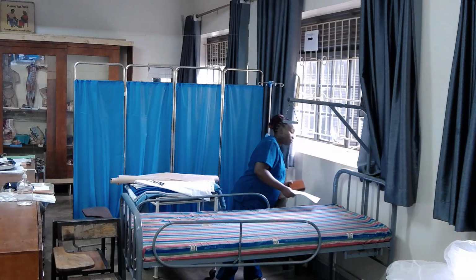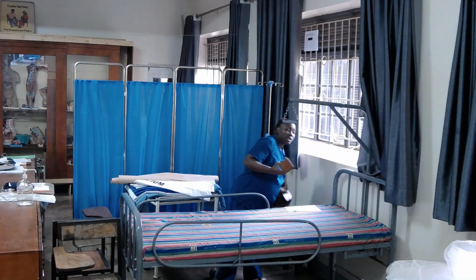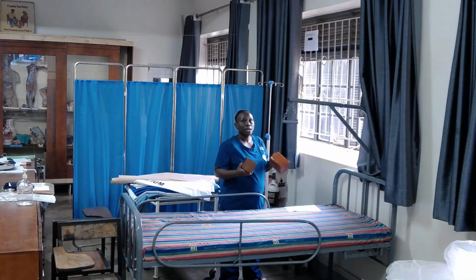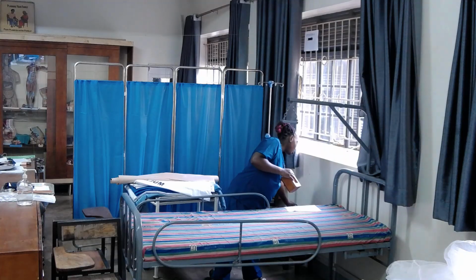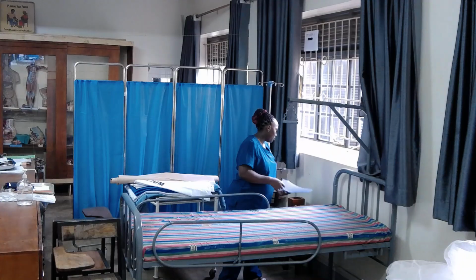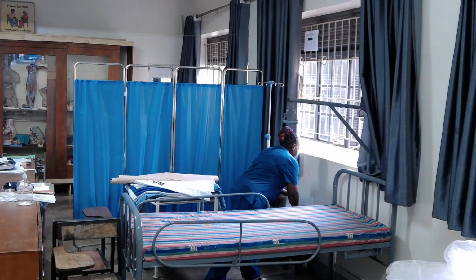So we also need bed blocks, and these bed blocks are put at the top of the bed to raise the top of the bed so that we decrease the intracranial pressure. But if you have that modified bed, you'll only raise, or you can use a switch or a remote to raise to about 30 degrees so that we reduce the intracranial pressure.